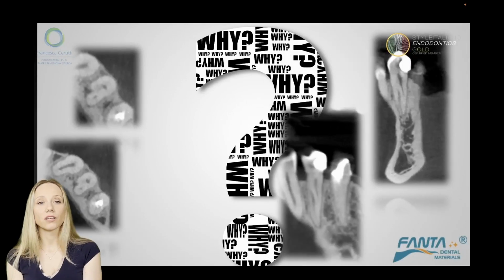And what do you see? Look at the anatomy of this root. There were two separate root canals. And look at the shape of the root. You can imagine this shape from the preoperative X-ray if your eyes are a little trained. But obviously you see it way better in the CBCT.